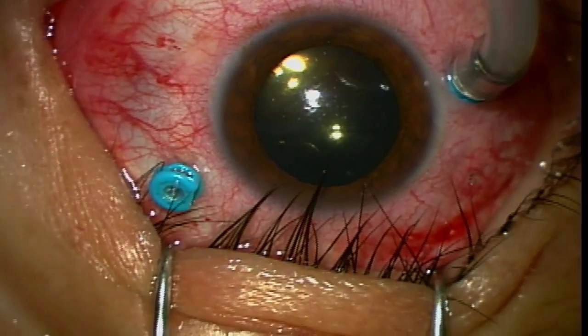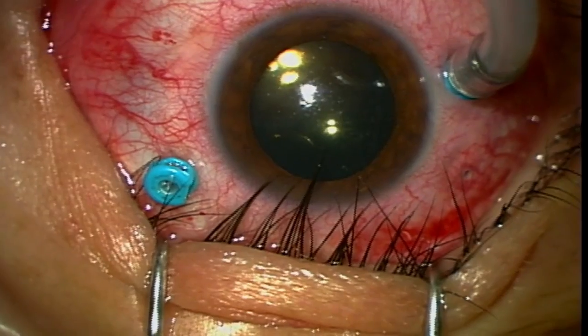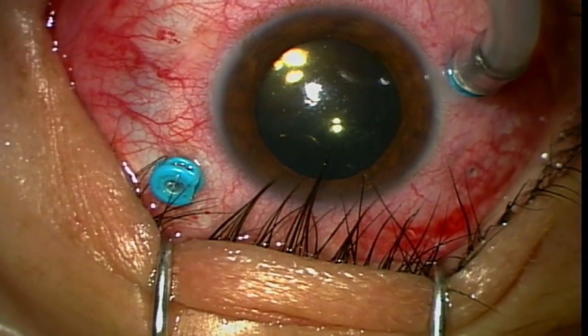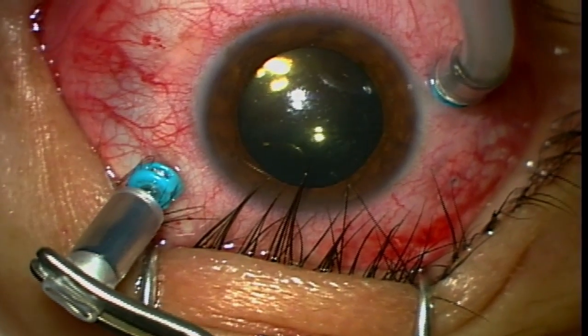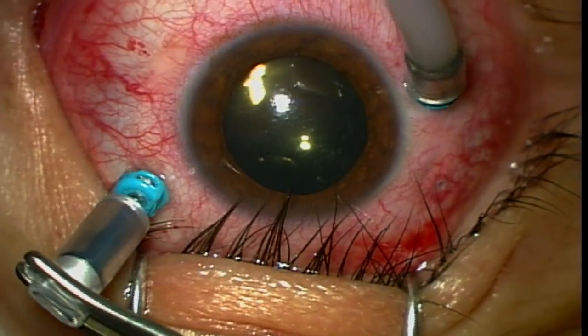At this point, the operation is basically done. The last thing I want to do is exchange the air for gas. I use a mixture of SF6 — I like to use about 15% because it doesn't expand. With proper head positioning, this will keep the retina attached until all the laser we did scars the retina into place.